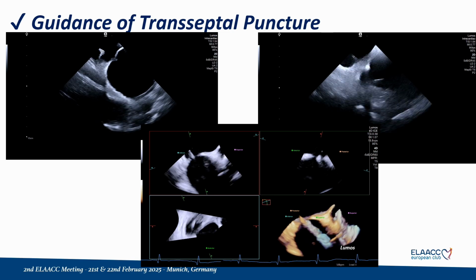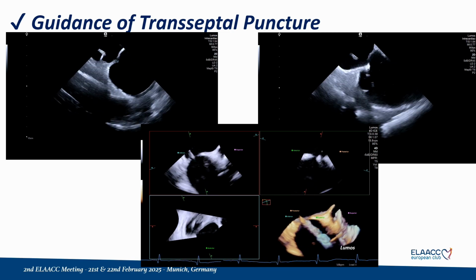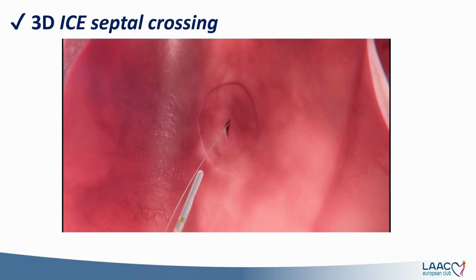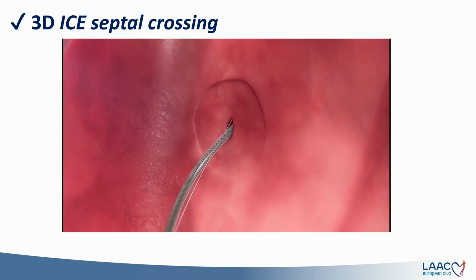Exactly the same we have using MPR, this is a Lumos. This device doesn't have the 3D ICE, but we can use the live MPR. In one shot we have a 3D and 3 different views in 2D.